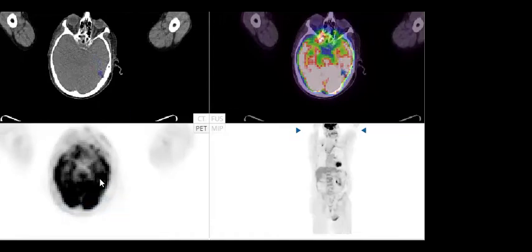That's why when you have a brain tumor, it's very difficult to detect it as a primary. That's why PET-CT in brain tumors as initial staging is not preferred. Maybe sometimes just incidental, but to be the first initial imaging is not preferred. Sure, the MRI will be the best.